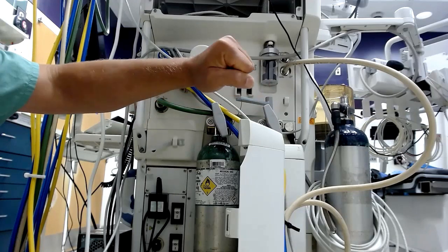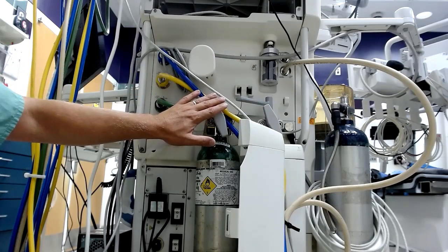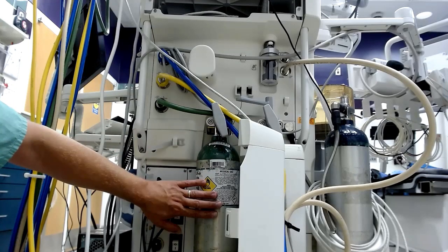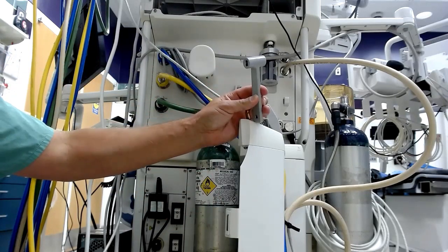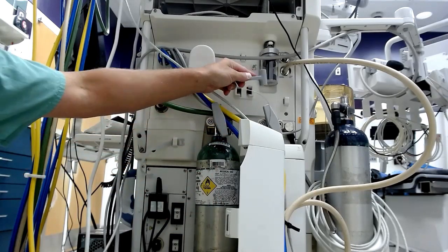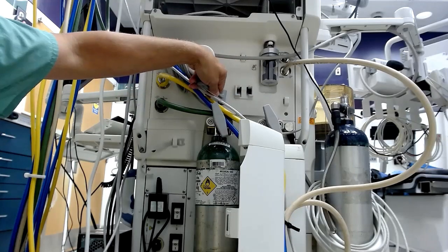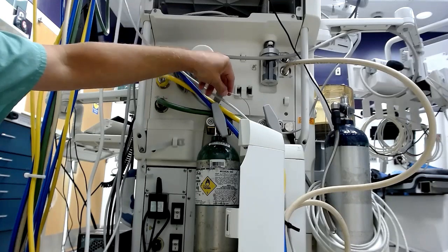To turn these cylinders on and off, we keep them off during the case so that they don't get drained, because the primary purpose for these cylinders is as a backup in case we have a pipeline failure. You're going to see a key, and I hope you can see this through the image. This key is left on top of our oxygen supply cylinder, and therefore if there's an issue, we can quickly turn the oxygen on and provide oxygen to our patient.